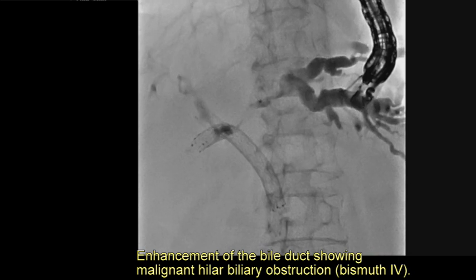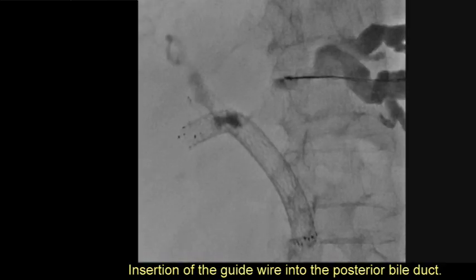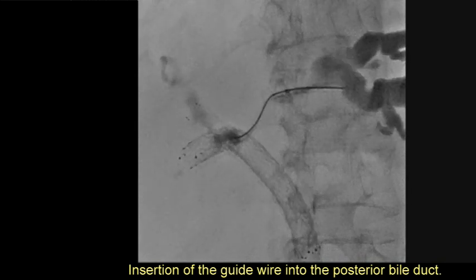Enhancement of the bile duct confirmed malignant hilar biliary obstruction, Bismuth type 4. A guide wire was then inserted into the posterior bile duct.